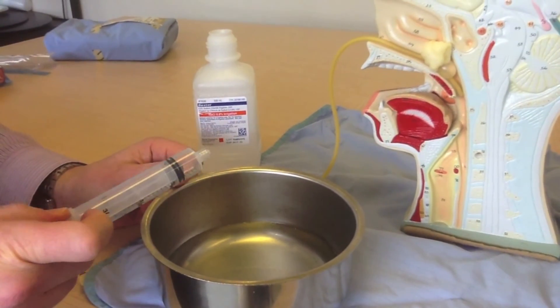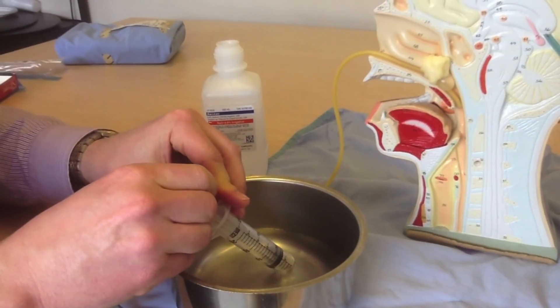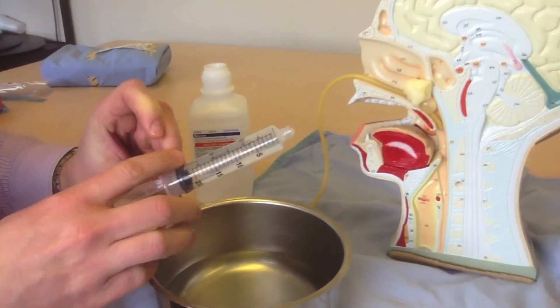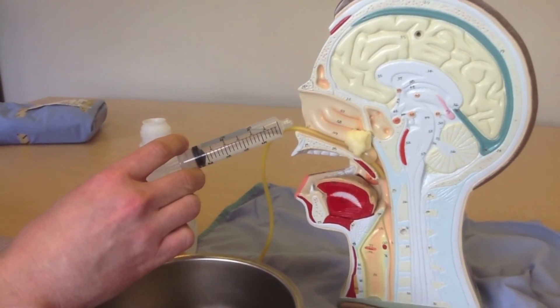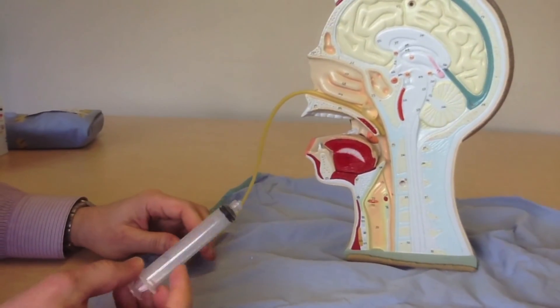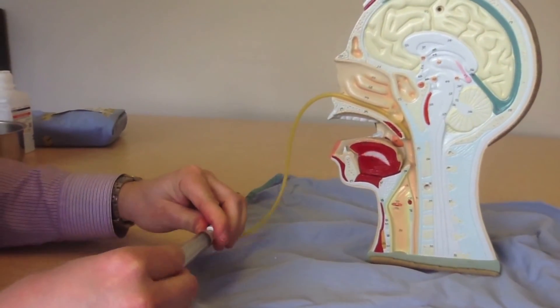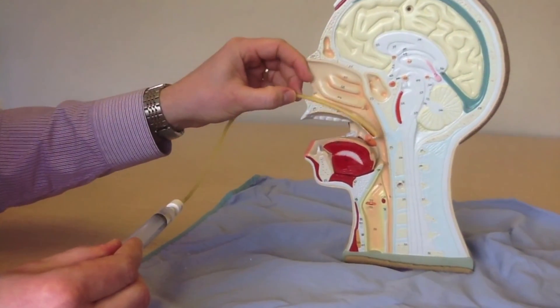Once 10 minutes has passed and the bleeding has stopped, have the patient tilt their head forwards and proceed to irrigate out the excess flow seal with sterile saline. Continue to irrigate until the irrigant comes back clear. Once the excess flow seal has been removed through irrigation, deflate the balloon of the Foley catheter and remove it from the patient's nose. If the patient is not bleeding, observe them for 30-60 minutes, and if there is no further bleeding, you may discharge them home.